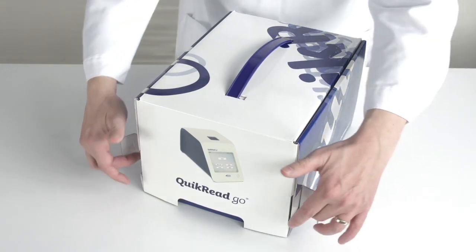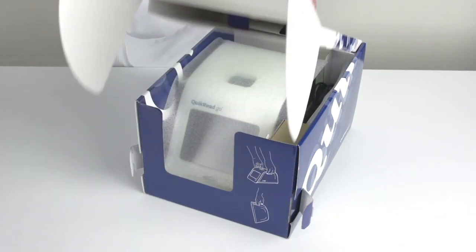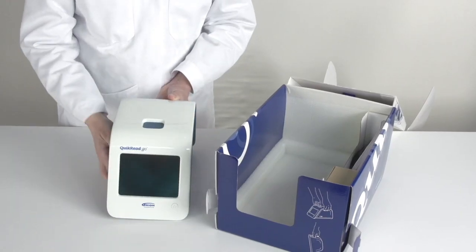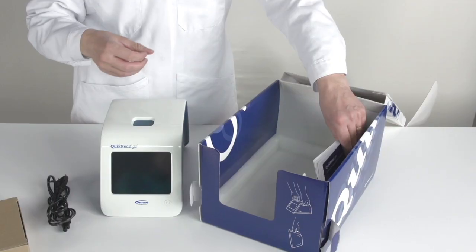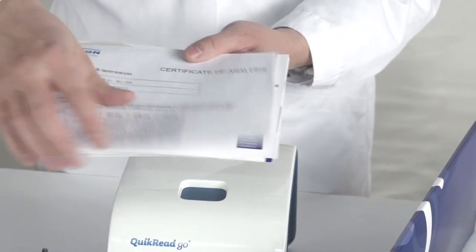After receiving the Quick Read Go instrument, open the packaging box carefully and lift the Quick Read Go instrument out of the box. Check that all these items can be found: mains cable, power supply, instructions for use, and instrument certificate.